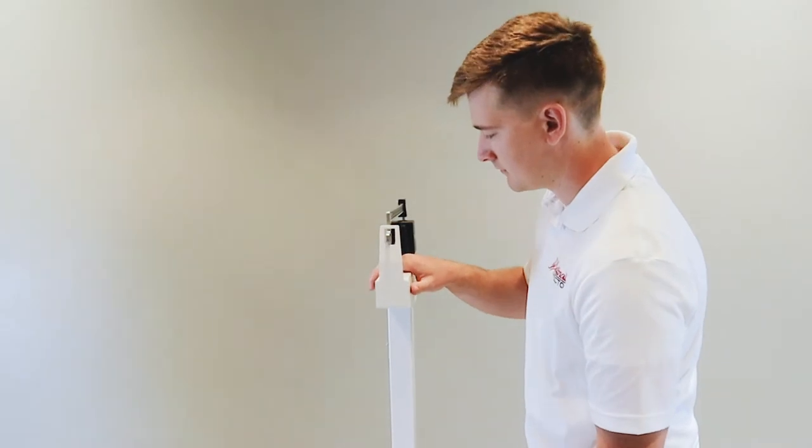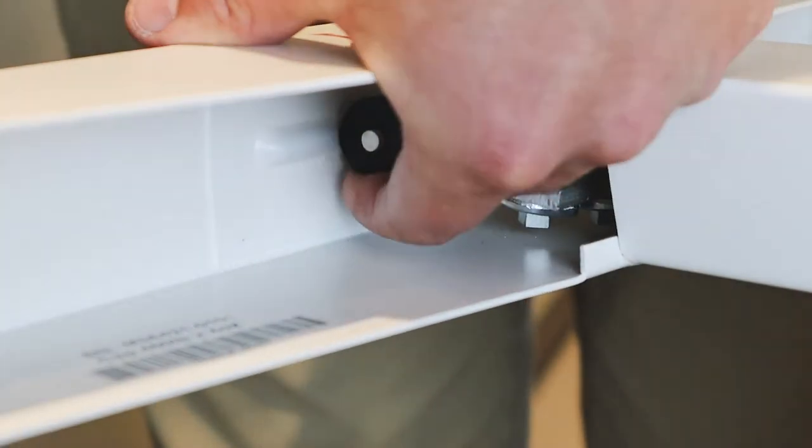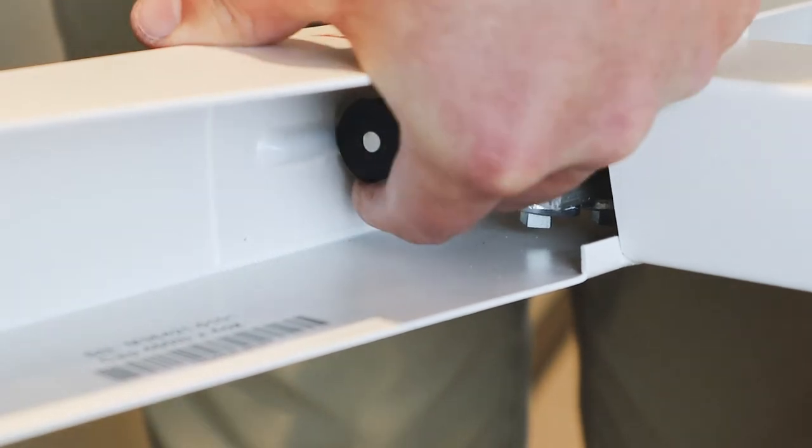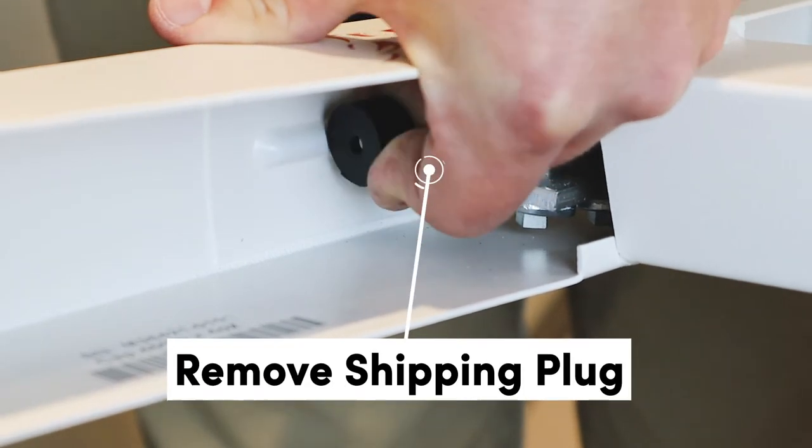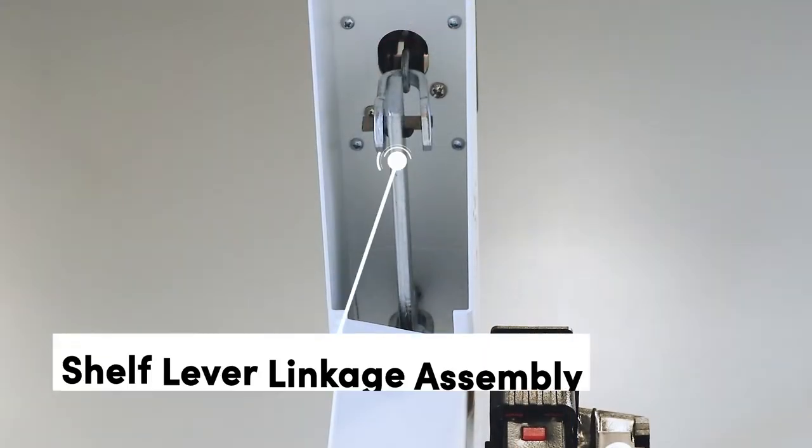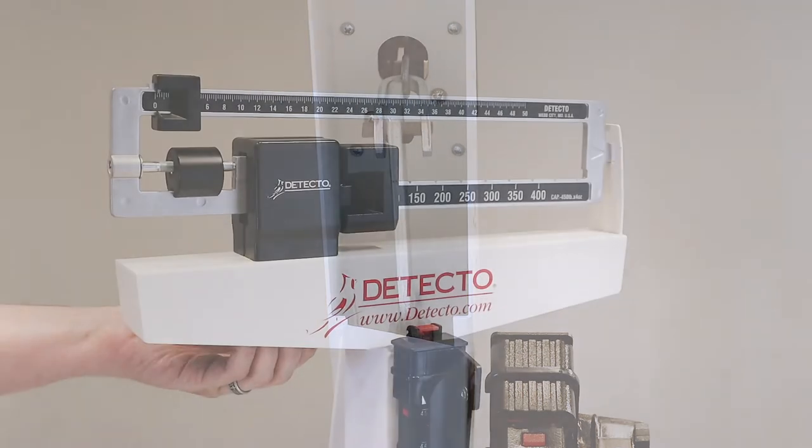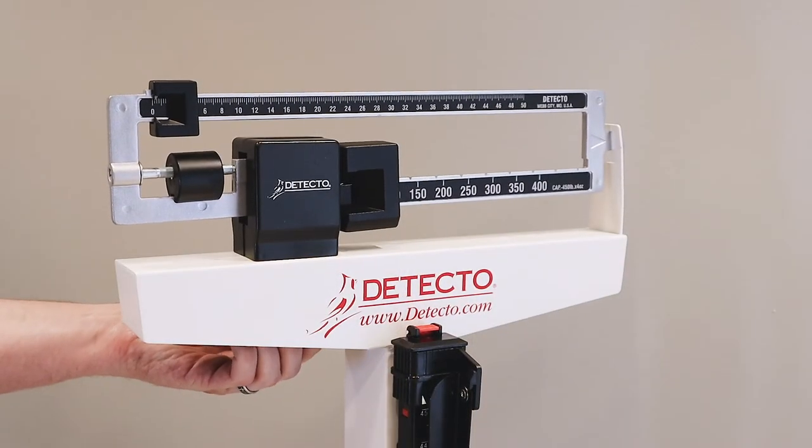Gently place the scale on the floor and slightly tip it to one side. The linkage and shipping plug can be seen by looking up underneath the way beam headpiece. Remove the plug and then visually ensure that the shelf lever assembly linkage is centered and properly aligned. The linkage must be free floating for the scale to weigh properly.